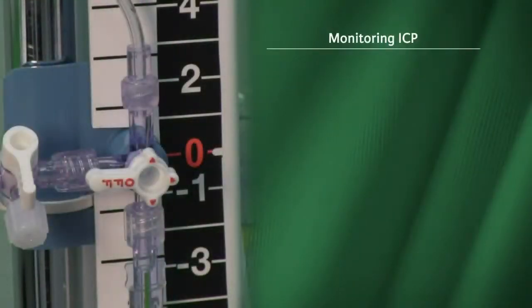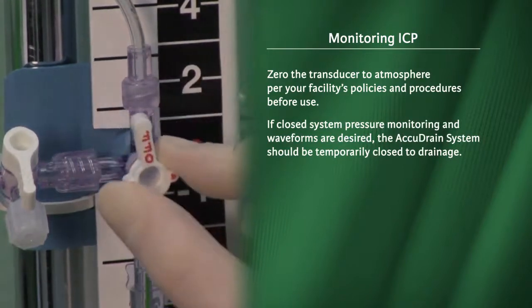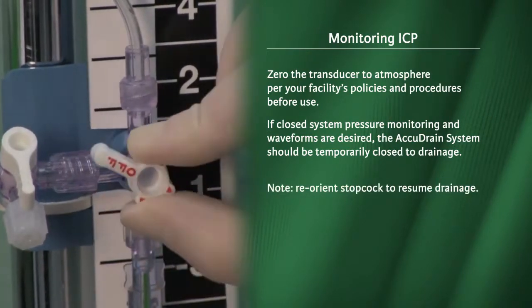Monitoring intracranial pressure. Zero the transducer to atmosphere per your facility's policies and procedures before use. If closed system pressure monitoring and waveforms are desired, the AccuDrain system should be temporarily closed to drainage. Reorient the stopcock to resume drainage.